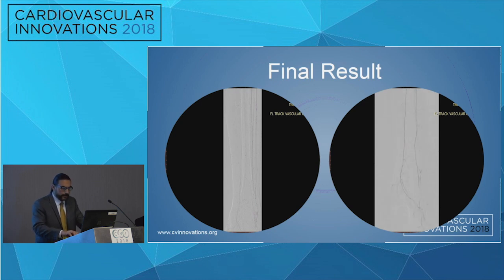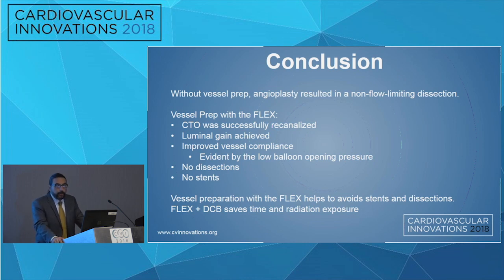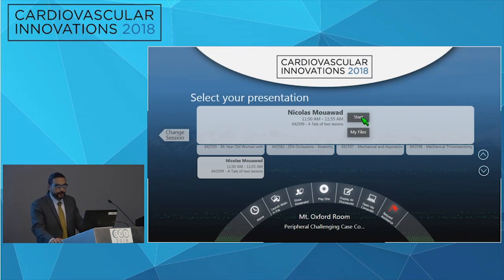So without vessel prep, as you saw in this kind of case control segment in the SFA, without pre-dilatation, the angioplasty, we did have a dissection that was non-flow limiting, just with the balloon angioplasty. With vessel prep, again, we were able to score the lesion. First of all, cross the CTO, score the lesion, get the luminal gain that we needed, and then ultimately assist in delivering the drug-coated balloon technology and let the paclitaxel do its work based on whichever excipient that you want. No dissections, no stents, which is what you want to avoid if at all possible. I found that it saves time, radiation exposure, very easy to use, 6 French platform. Thank you so much.